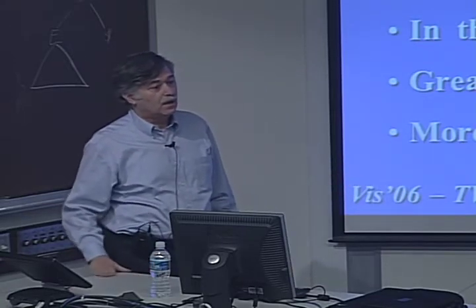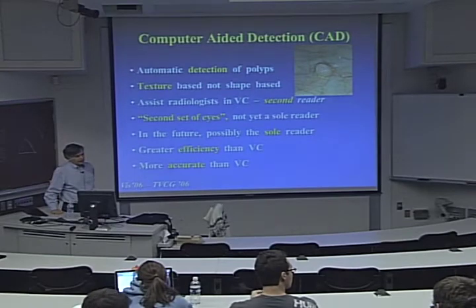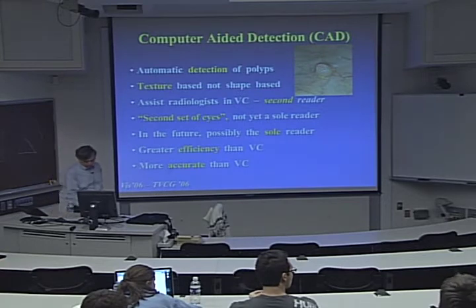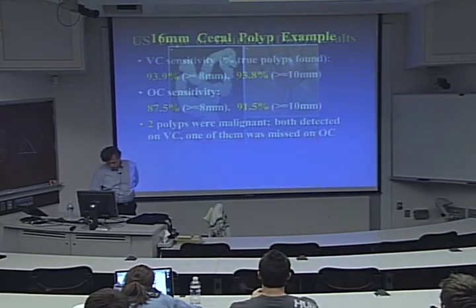The question I think that isn't clear to me is when you say it has 94% sensitivity, that presumably means that 94% of the polyps over 8 millimeters, or whatever the threshold is, it detected. Okay. How do you find the 6% that it did not detect? The question was, what is the 100%? What are the few percent that are not right? I think that was your question, right?